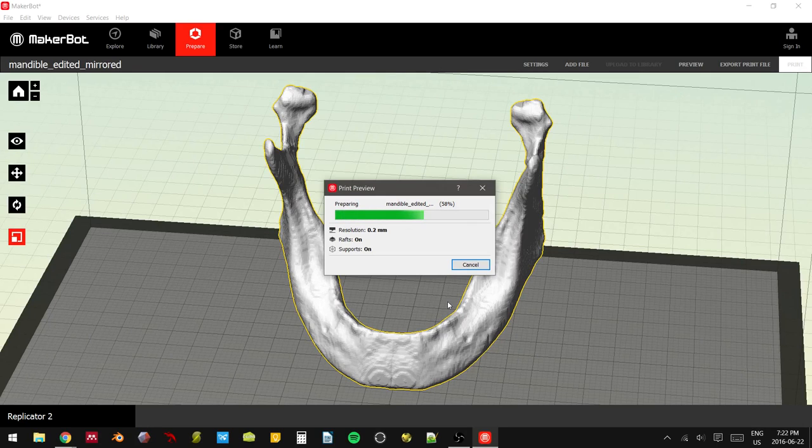One of the most common questions that we get around here is what kind of 3D printers do you guys use? In our lab, we have access to some of the higher end stuff like the Connex and the Objet30 Pros. And I guess the Dimensions, which are still kind of high end, even though they're super old now. At least the ones that we have access to, but they're okay.